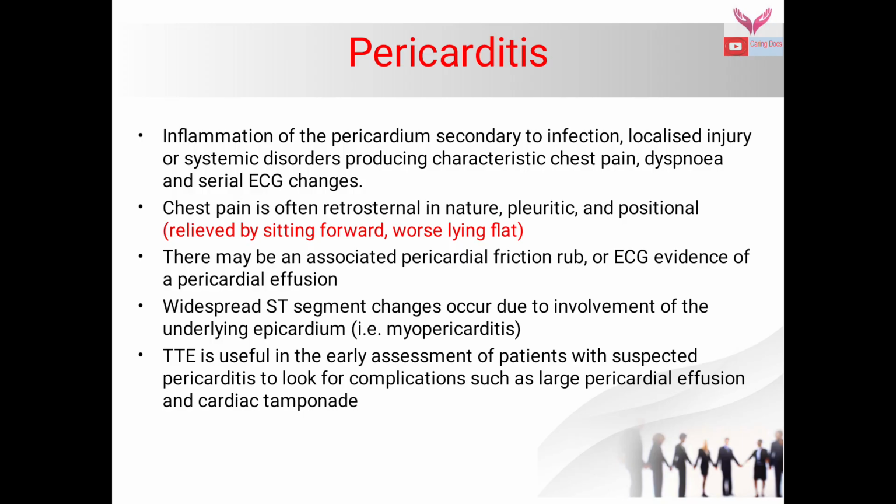Transthoracic echocardiography is useful in the early assessment of patients with suspected pericarditis to look for complications such as large pericardial effusion and cardiac tamponade.